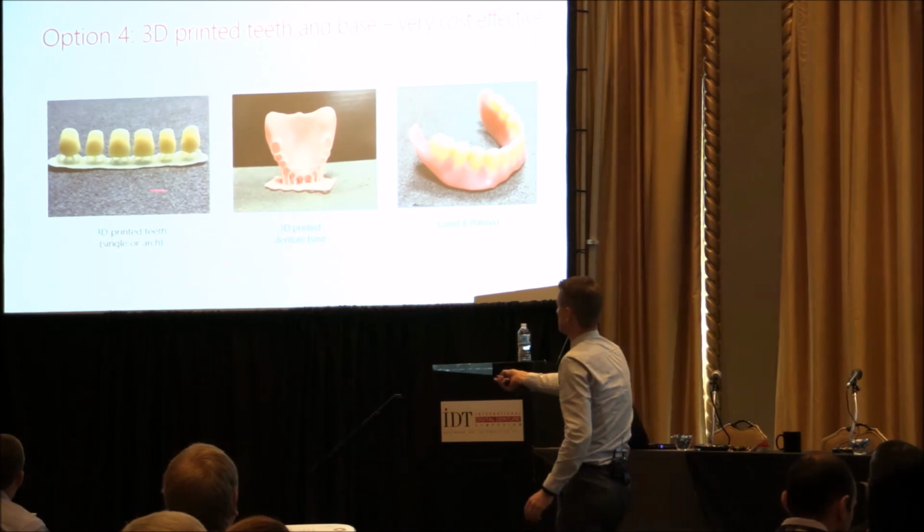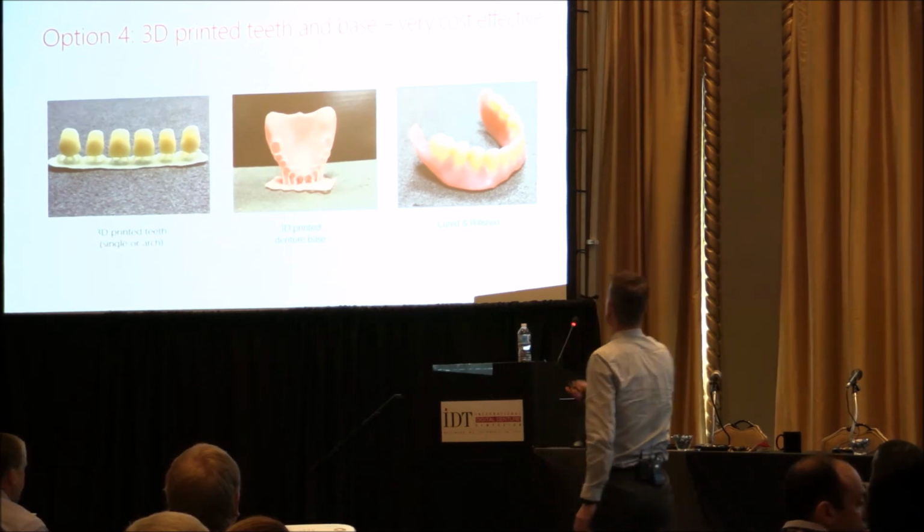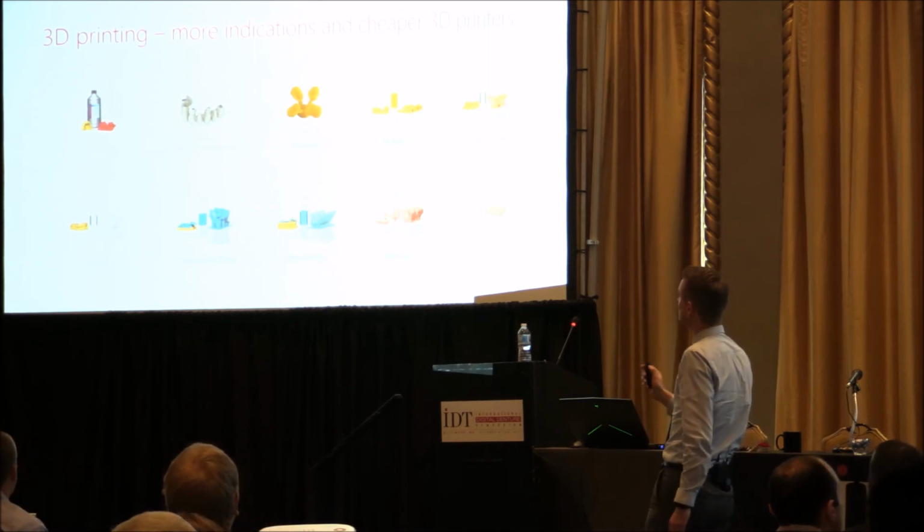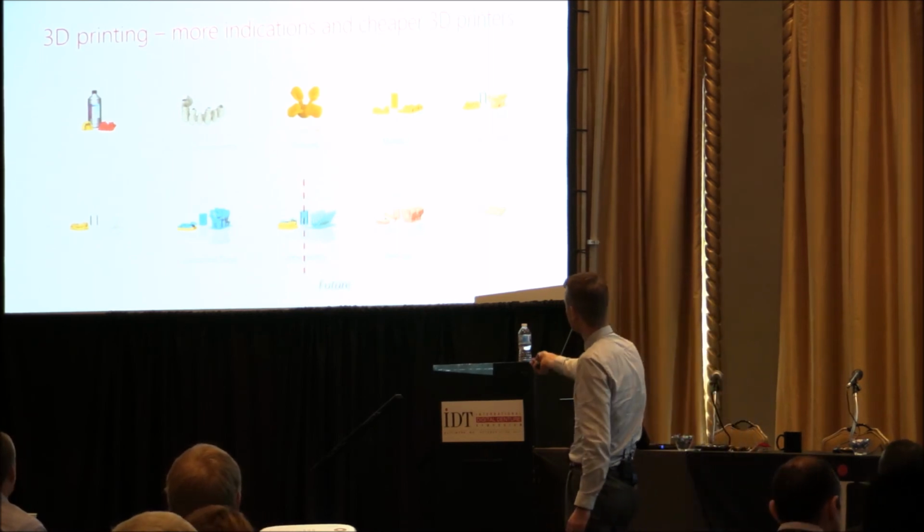What are you doing? You're basically printing the teeth, you are printing the base, and you're curing and polishing. All right, I don't have really time to talk about this, but right now we are down here.